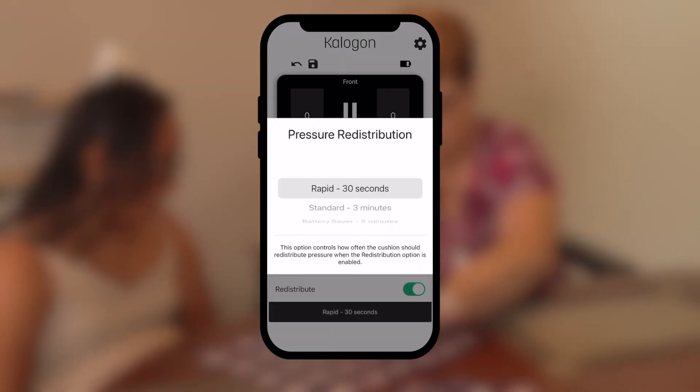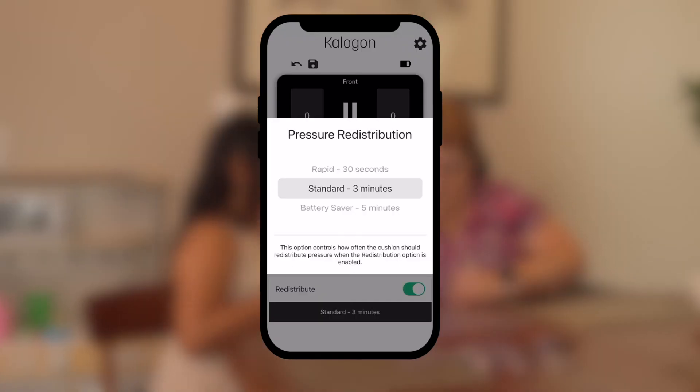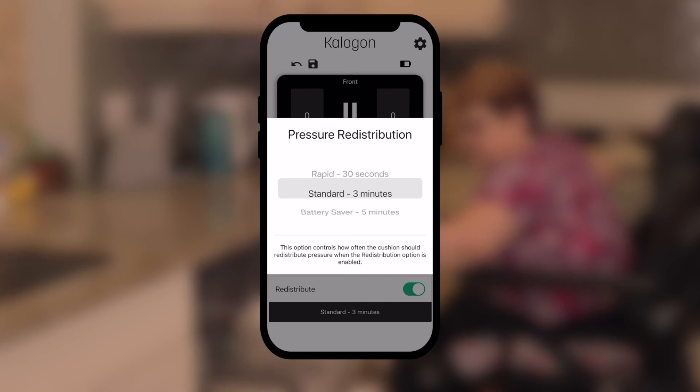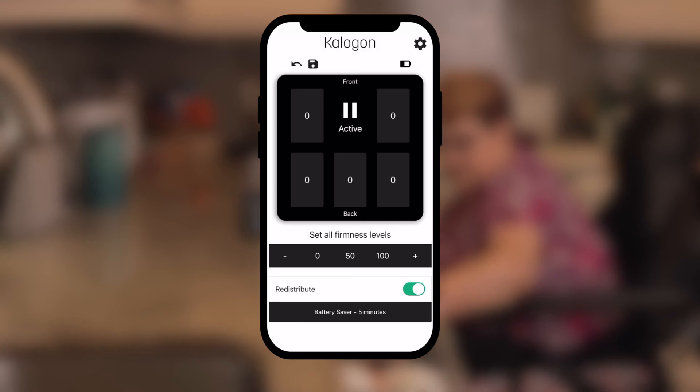The time cycle at the bottom of the screen determines how often the cushion will redistribute your weight and circulate the blood. We recommend setting it to every three minutes for optimum battery life of 14 to 16 hours, or select a more personalized setting to provide consistent offloading.